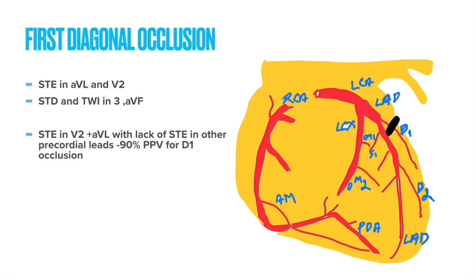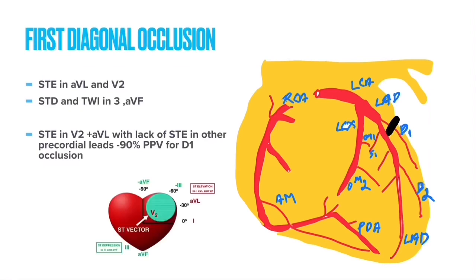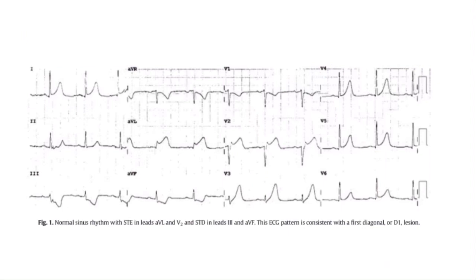Here we can see this is the first diagonal branch which is blocked in this ECG. When D1 is occluded, the ST vector goes towards lead V2, lead AVL, and lead I, and also towards the negative poles of leads III and AVF. So there will be ST elevation in V2, AVL, and sometimes in lead I, and ST depression in leads III and AVF. The key finding is definitively ST elevation in lead V2 and AVL with ST depression in lead III — this pattern indicates D1 occlusion.